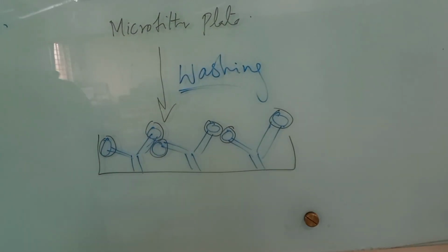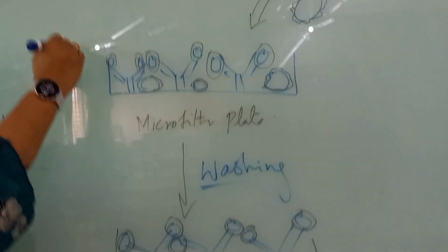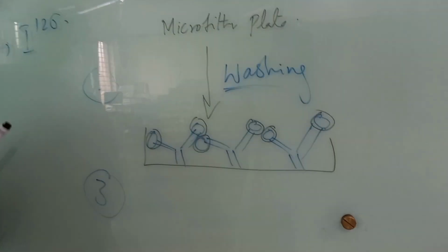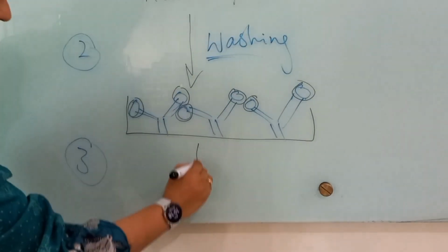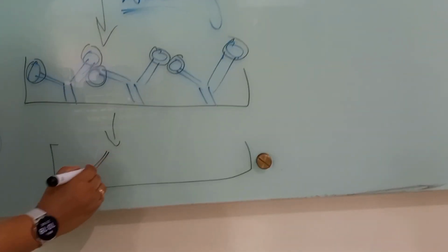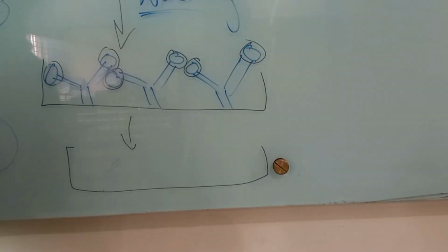This is step 1, step 2 is washing, and in the third step we will add the sample.